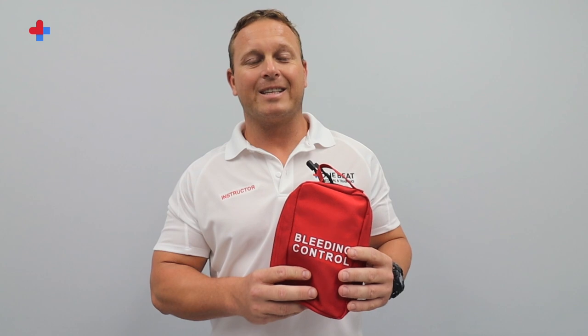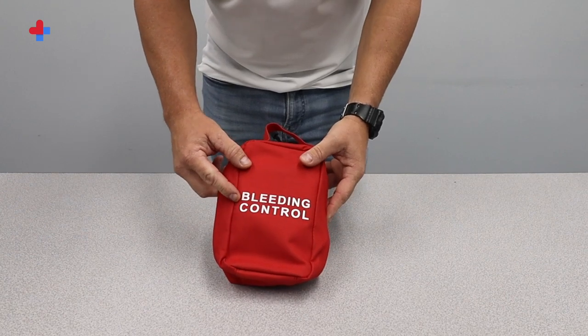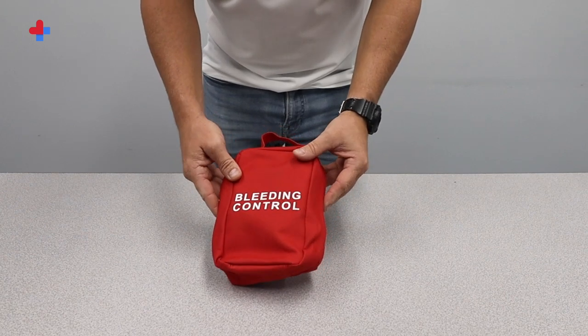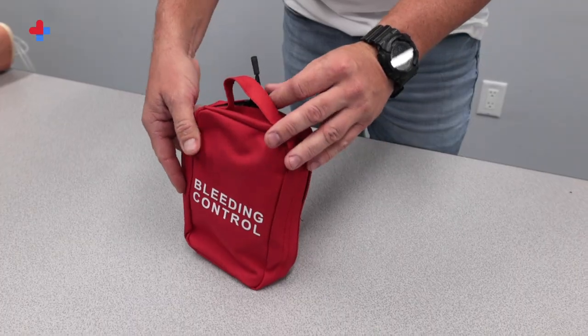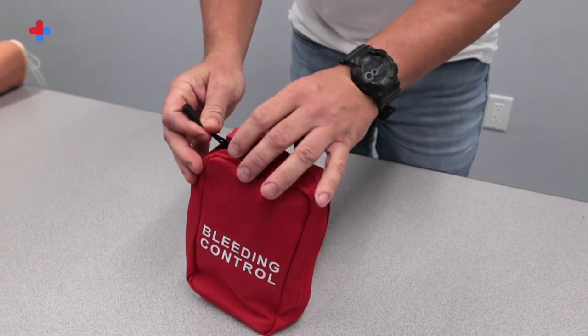The One Beat Medical and Training Bleeding Control lineup has been designed to provide bystanders and first responders with quick, easy access to essential medical equipment for stopping life-threatening bleeding. The kit is clearly and boldly labeled and packaged in a lightweight, compact, highly visible red nylon pouch with easy-to-grasp dual zipper pulls for rapid access.